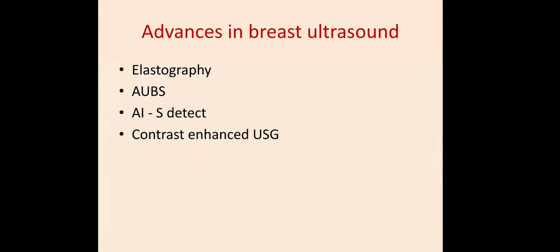Now, regarding the advances in breast ultrasound, elastography has been used for many decades, and among these advances, only elastography is commonly used by many breast radiologists nowadays, whereas the others have very limited availability. And regarding contrast ultrasonogram, it is not very important because you need an IV line, you have to give intravenous contrast, and after giving contrast, you see the real-time vascular pattern of the lesions, and it is found that it doesn't give any definitive diagnosis. So whatever the findings, you have to do a biopsy for morphologically suspicious lesions. So it has not gained much importance in breast mass evaluation.